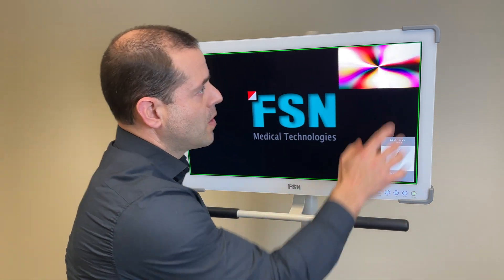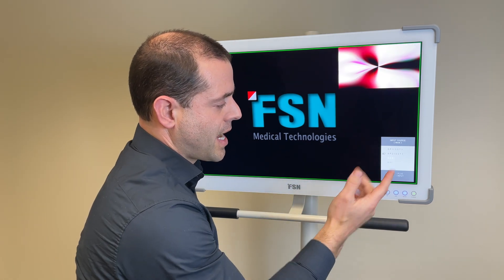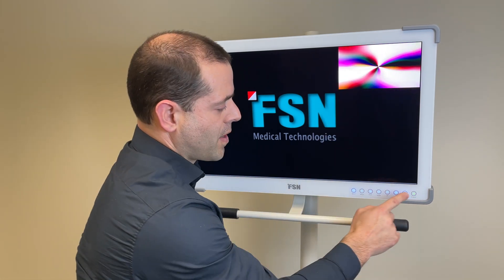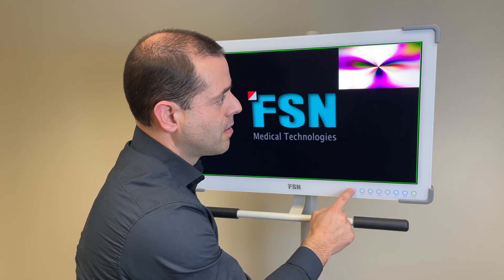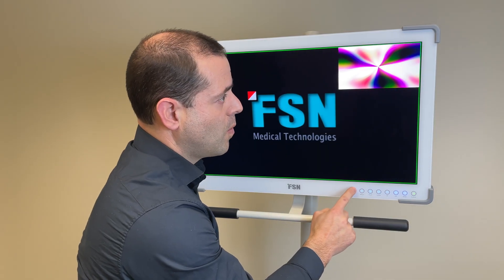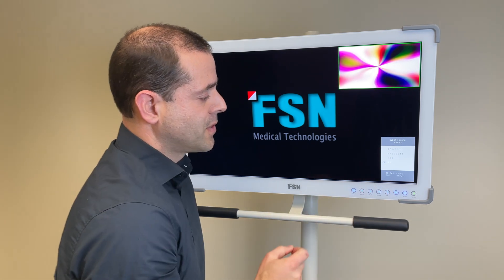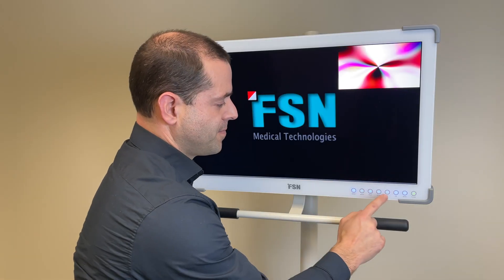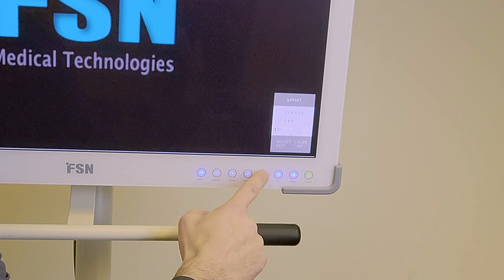Go into input — we selected this one and now we can change that to DisplayPort 2 or DVI, etc. If you want to change the picture-in-picture input, press once or twice — the big one with the small one — and you can change it to another input. It's very useful. To exit, go to picture-in-picture and go up to single and select it.